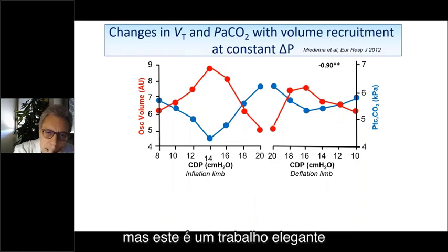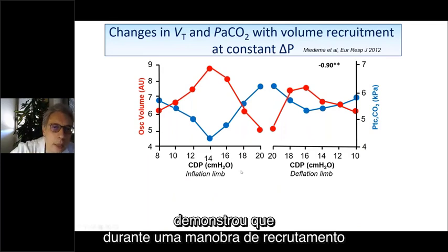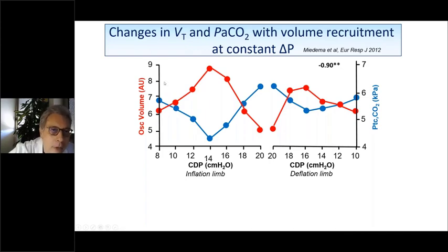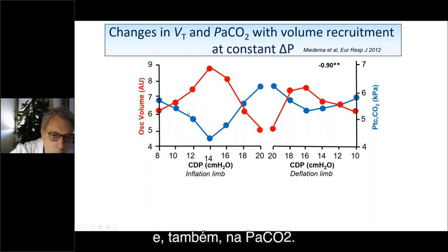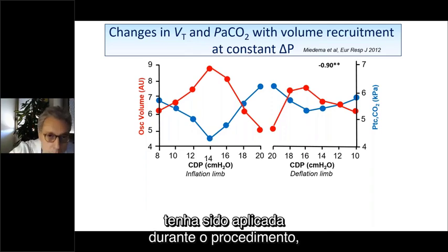But this is an elegant work by Miedema and the Van Kaam group that demonstrated that during a recruitment maneuver in high frequency oscillatory ventilation, there are dramatic changes in tidal volume and also in PaCO2, even if no changes in the delta P were applied during the procedure.